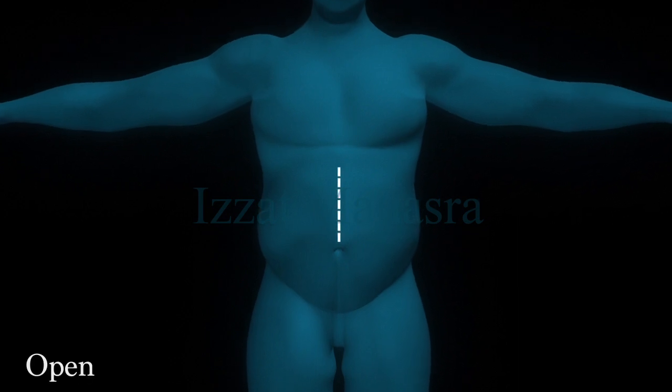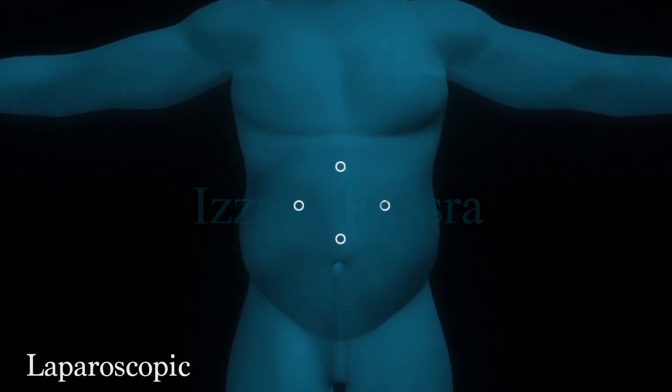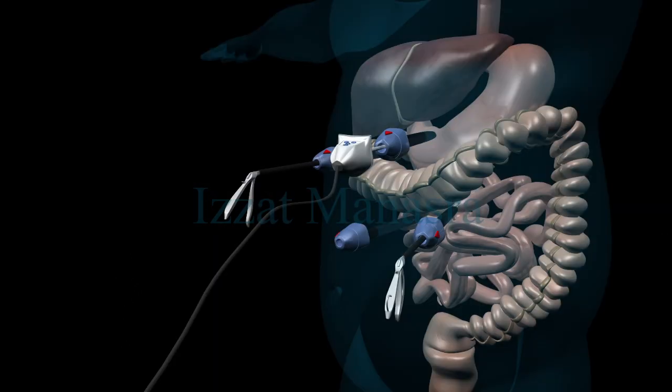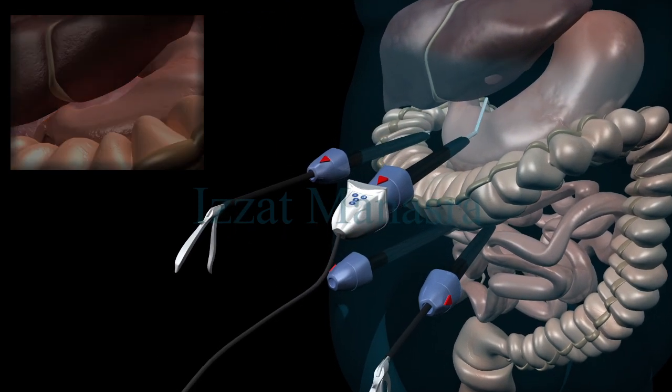Your surgeon would use one of two methods for gastric bypass surgery. The open method requires an 8 to 10 inch incision in the abdomen. The laparoscopic method only requires several small keyhole incisions, through which your surgeon will pass a laparoscope and surgical tools. A laparoscope is a thin lighted instrument that projects images of the surgery on a monitor in the operating room.